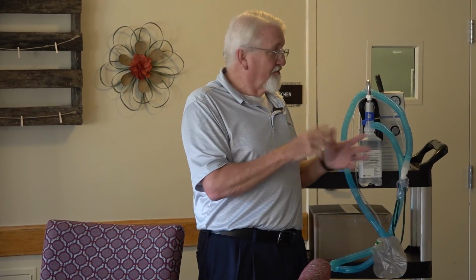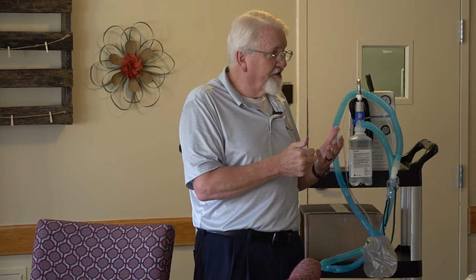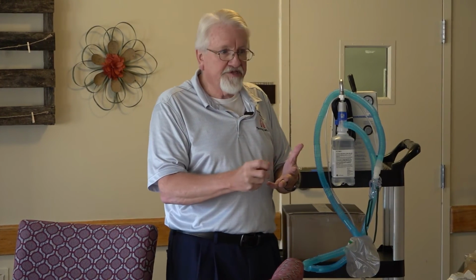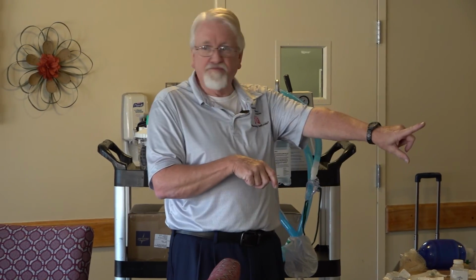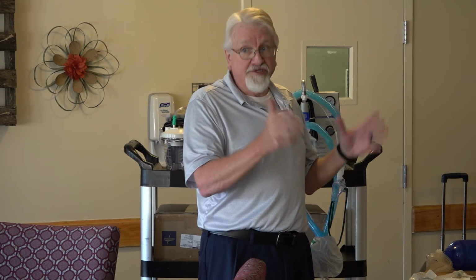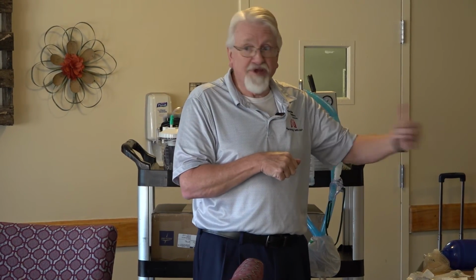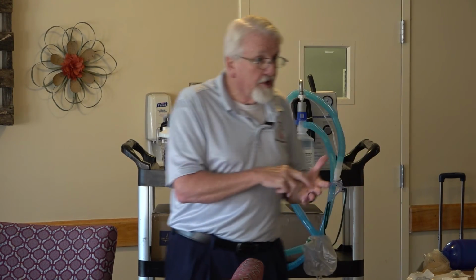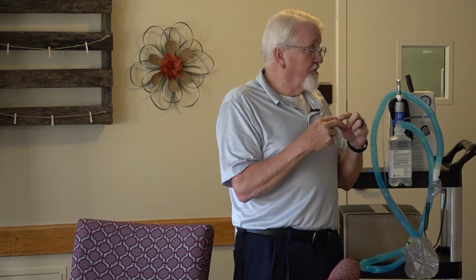Before we get the regulator on there, you're going to do what we call cracking the cylinder. After you've removed the little plastic piece and the washer, you're going to point the direction of the outlet away from you, and you're just going to pop it. That's going to make sure that valve is blown clean. Then you're going to line up the pins on your regulator, and your washer is going to be in place.